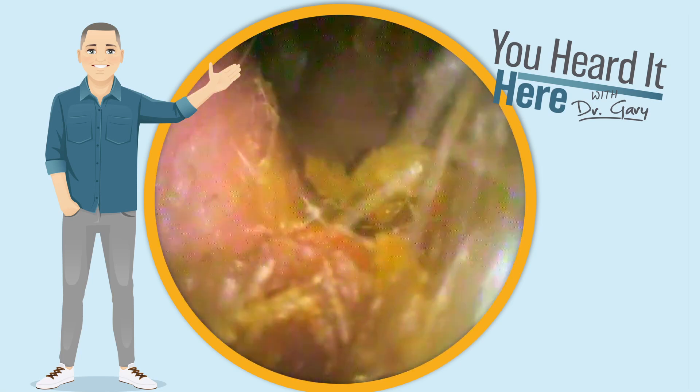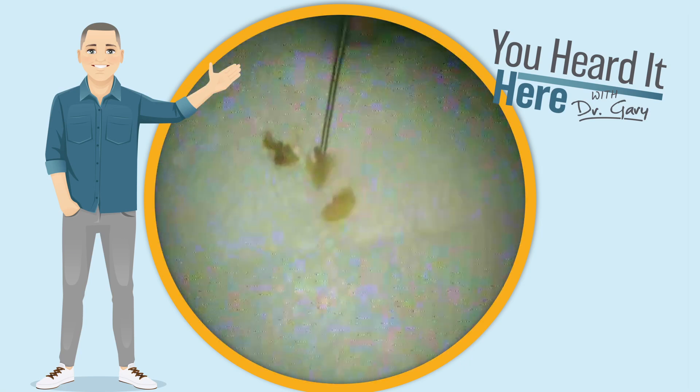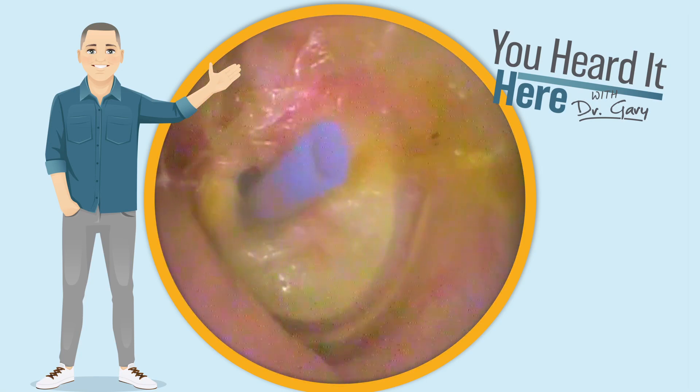Every time we see these, we always try to record the video because PE tubes in adults are not nearly as common as PE tubes in children. Look at all that that came out. As we look back in again, we get a great view of the eardrum.